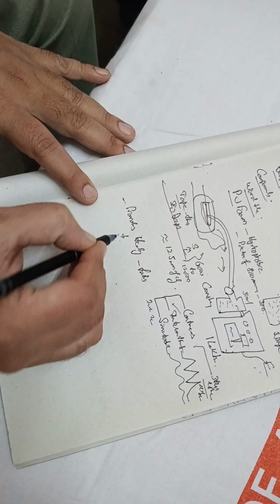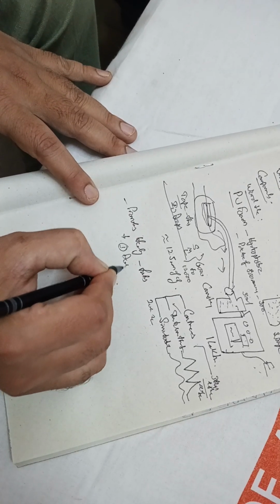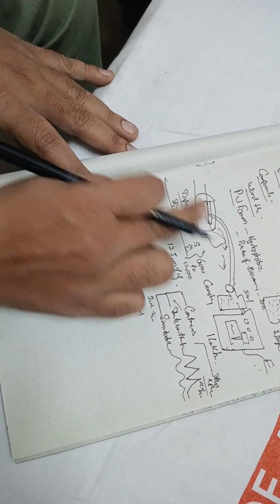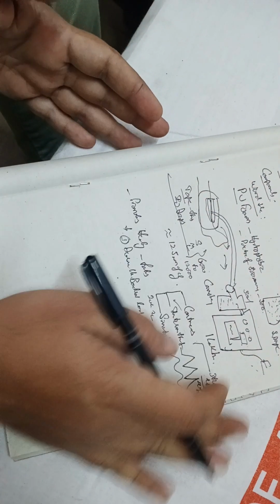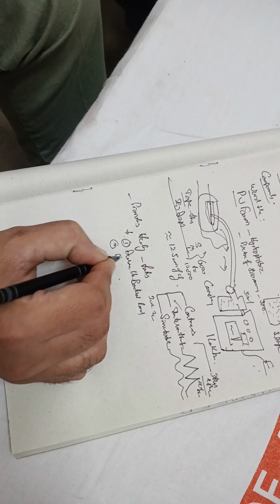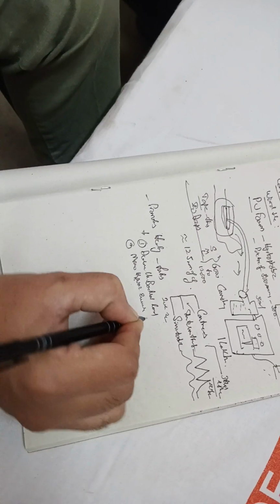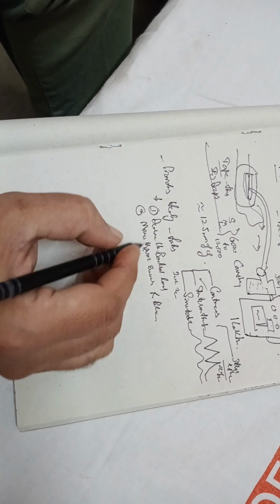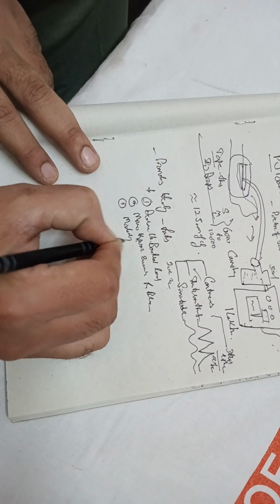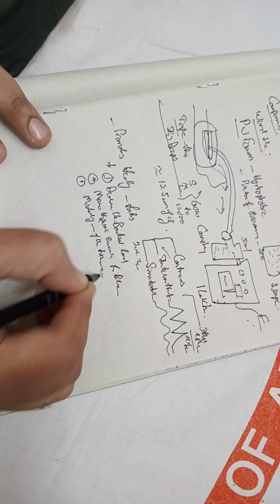So how it promotes healing, there are a lot of things. It decreases the bacterial load. The bacteria which are growing there cannot grow; they keep on getting sucked. Then it causes a micro hypoxic environment for bacteria. And then it causes modeling of the tissues, granulation tissues.